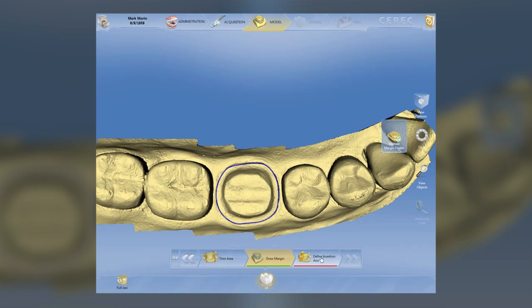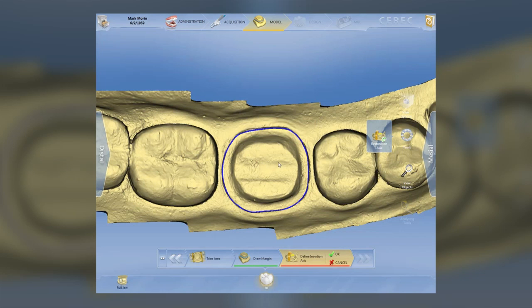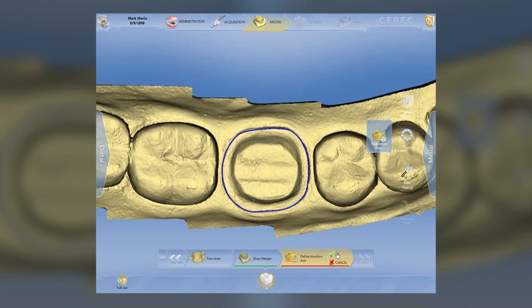Once we set our margin, you see down here that 'define insertion axis' has a red line underneath it — that means I haven't done that step yet. So I'm going to click on that step and move forward. Now I'm going to set up the insertion axis. If you don't move the model a lot, as I've told you, you've done a good job with your pictures. If you've got to move the model a lot, the machine is telling you it should have a better picture. Once I get it accurate and set, I hit the green check mark again. Those three steps are now complete — they're all green. And now what do I do? Go forward.